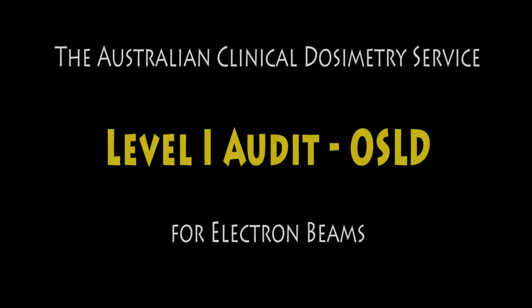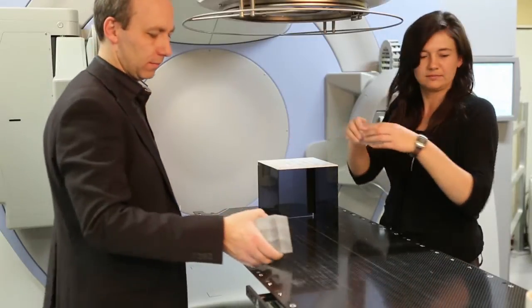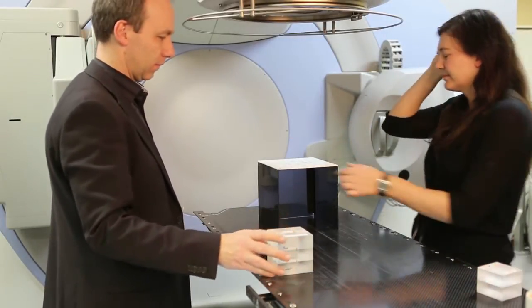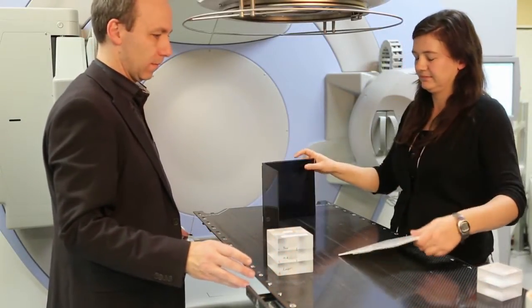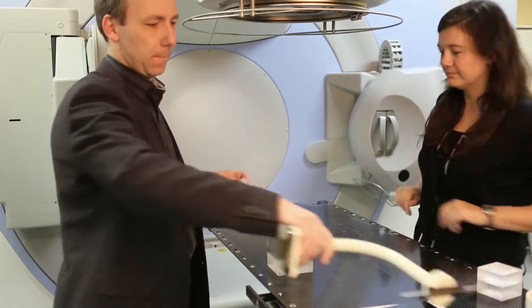Welcome to the ACDS Level 1 OSLD audit for electron beams. Once the photons have been completed, take down the platform and stand. They are not used for the electron irradiations.